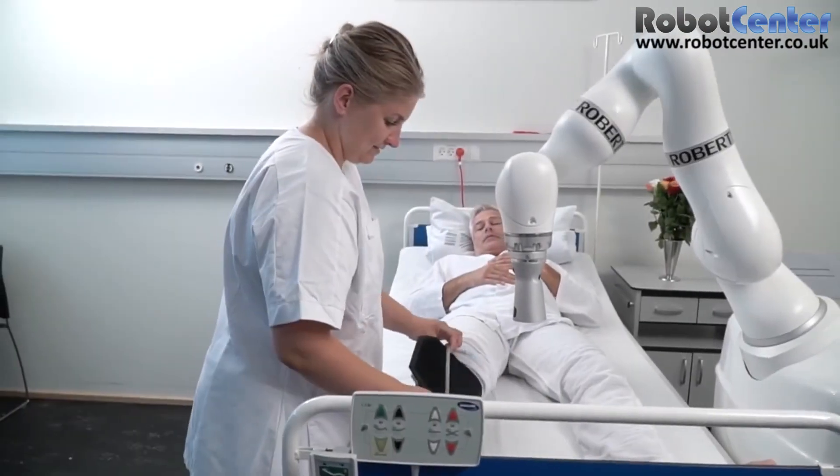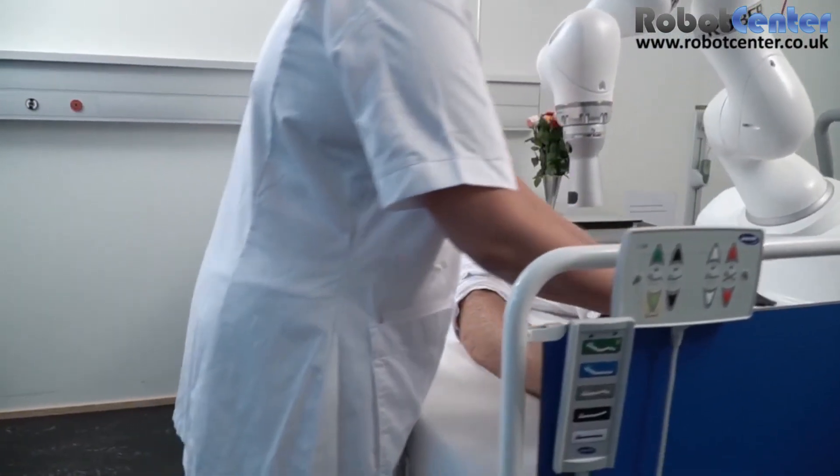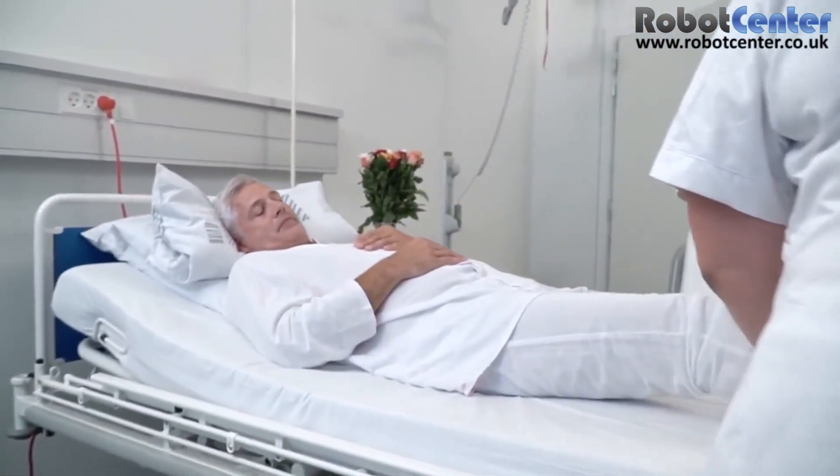Together, the enhancement of the patient's blood flow and the minimization of the risk of complications will mean a reduction in inpatient stay. It will be feasible to treat more patients per bed per month.